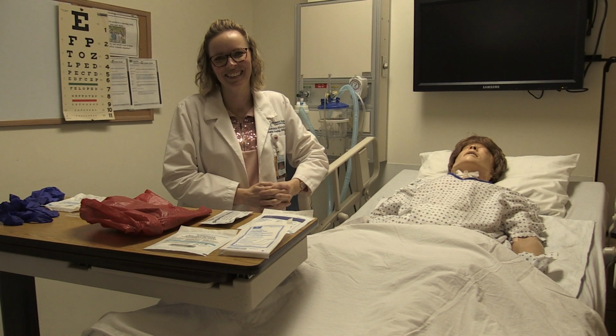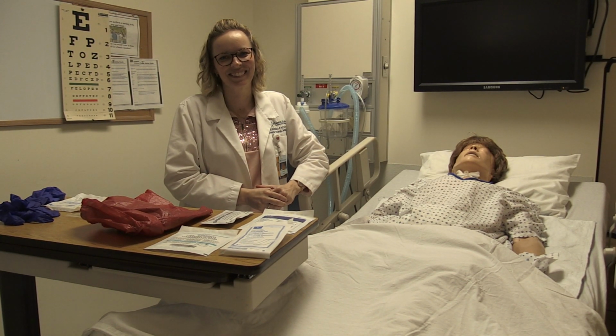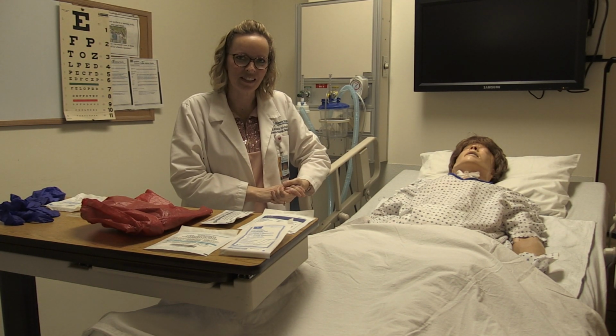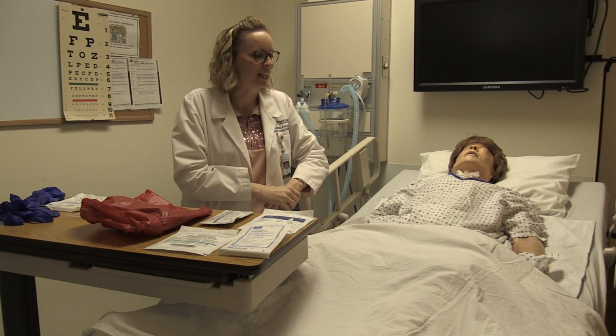Today we will be demonstrating sterile dressing change for an acute surgical wound with a drain. All right, I'm going to go ahead and verify the physician's orders. I'm going to come in the room. I'm going to provide privacy. I will introduce myself to the patient.